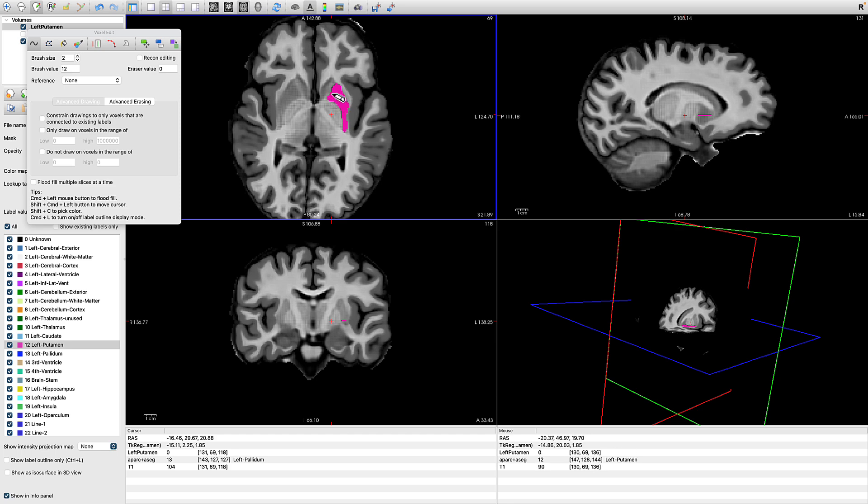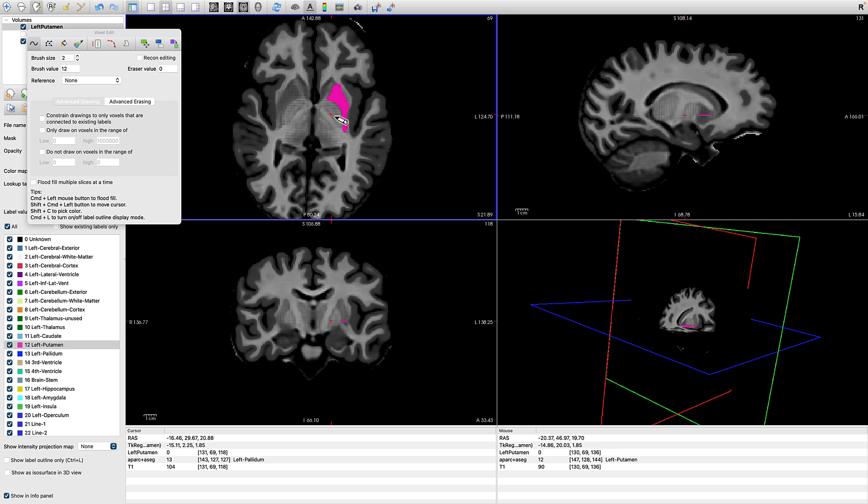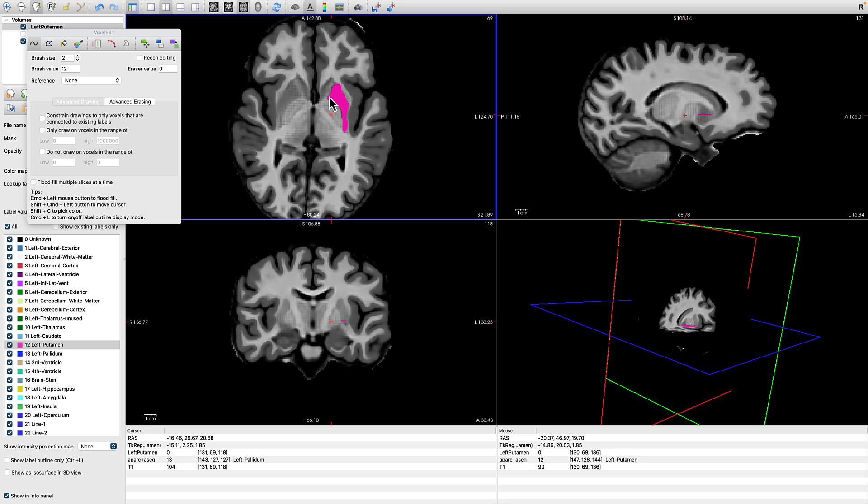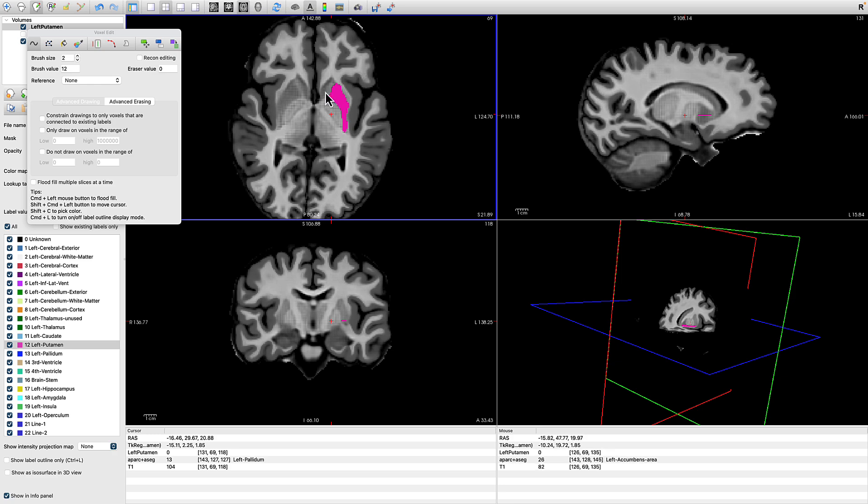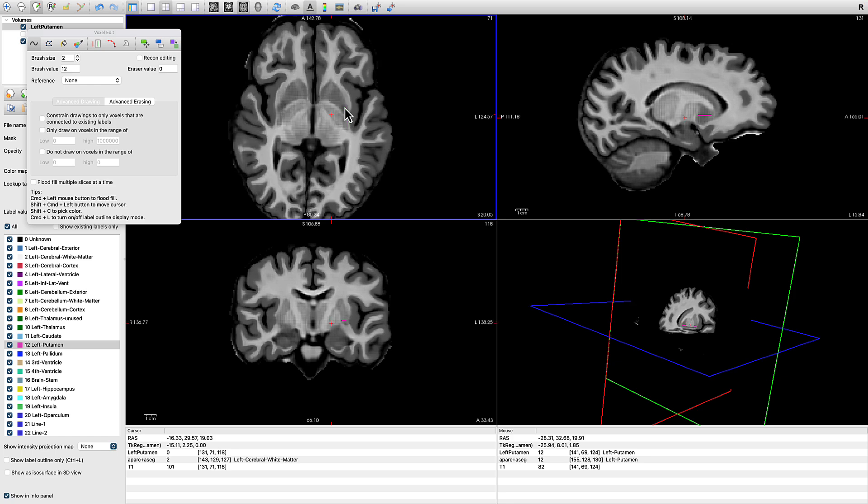So just keep going, see how much you need. And if you need to, you can also hold shift and right click to change the overall contrast to give you a better sense of the boundaries between the putamen and the other structures. Now the putamen and the globus pallidus form something called the lentiform nucleus. It's a core structure of the striatum and the basal ganglia, very important in things like movement and coordination. The nucleus accumbens on the other hand is involved in reward processing. It receives a lot of dopaminergic projections from the ventral tegmental area, the mesolimbic system.